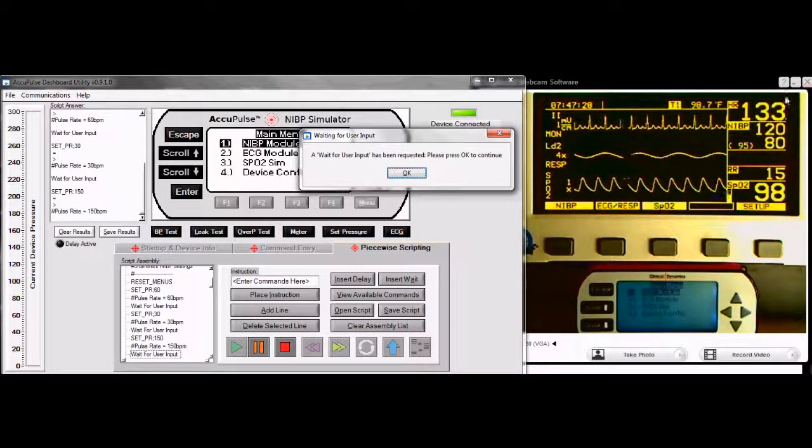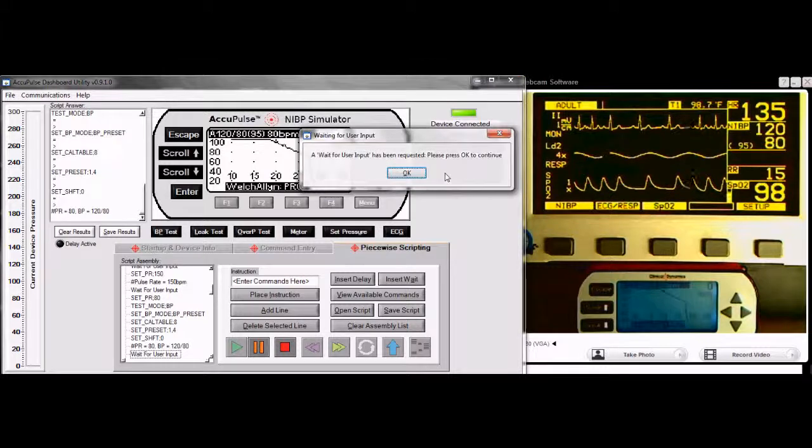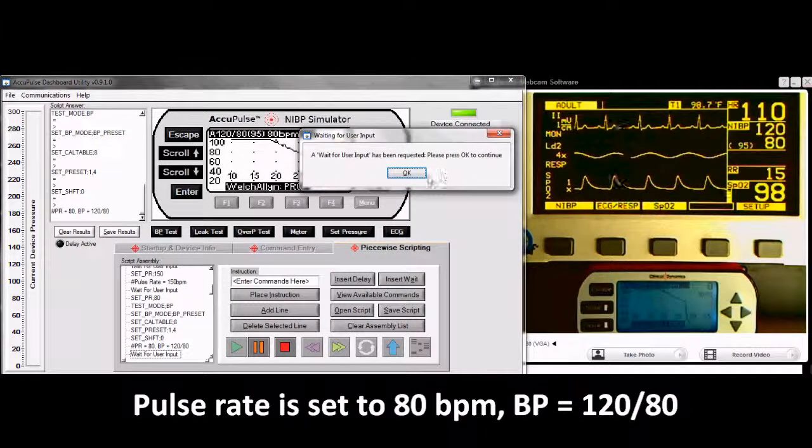Script files can systematically step through all signal ranges, exercising the full range of the electronics and transducers of the monitoring system. It can be configured to cycle and repeat measurements over an extended period of time. AAMI SP10 standard guidelines for comprehensive, non-invasive blood pressure testing can be performed utilizing program automated script files.